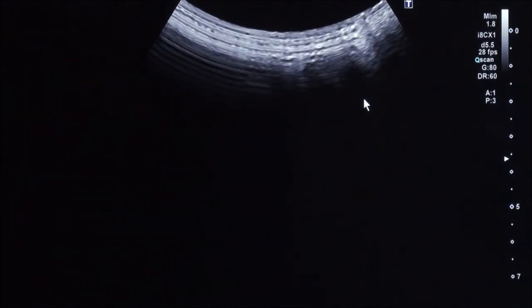All in all, if the patient doesn't require surgery, this is a really quick clinical tool that allows us precision — because oftentimes herniated discs are not always very clear, and confirming that there is a herniated disc and matching that with the clinical history is very important. Thank you very much.